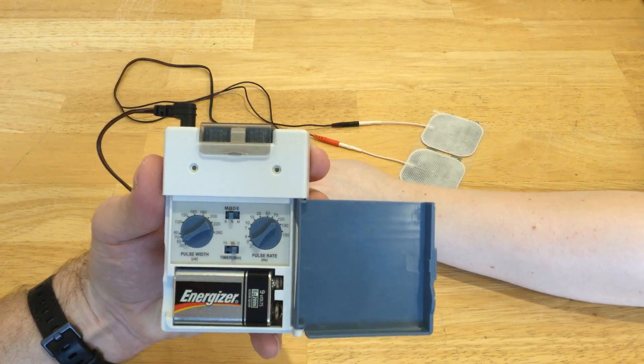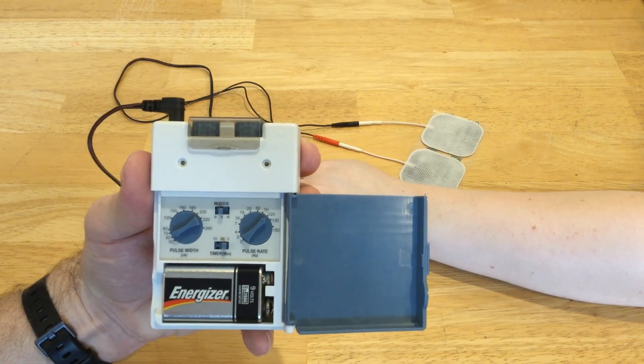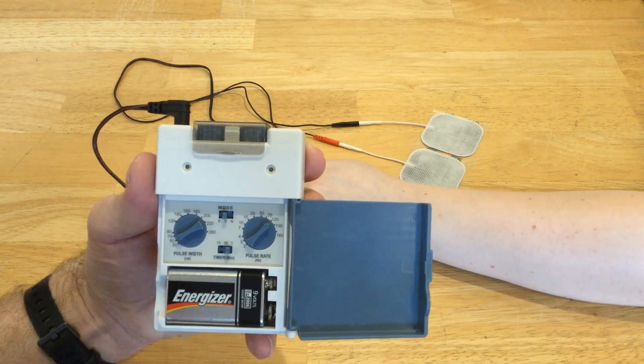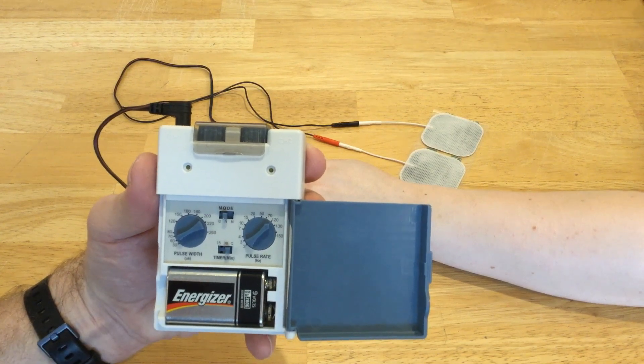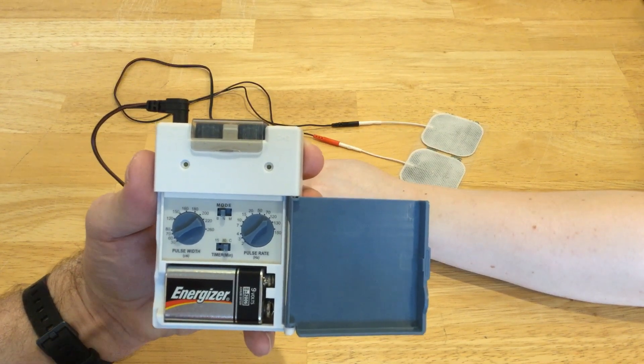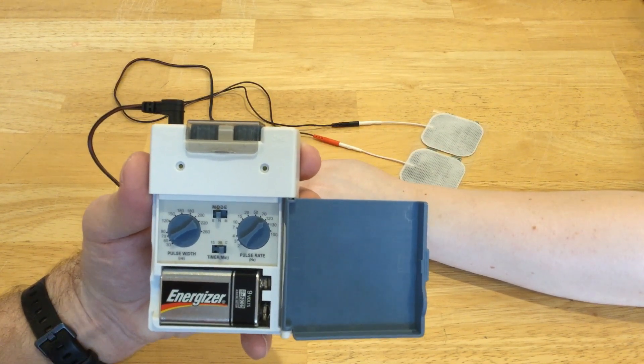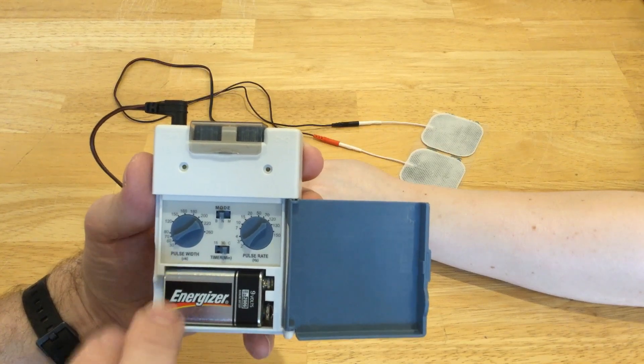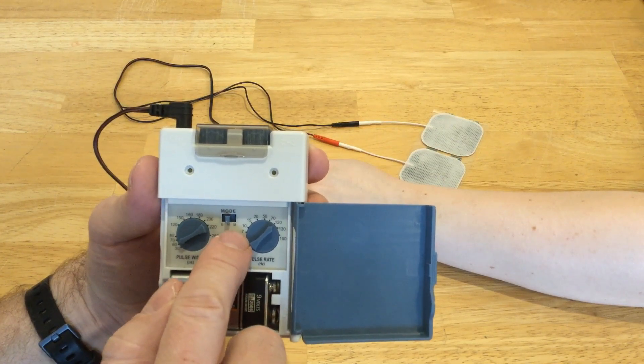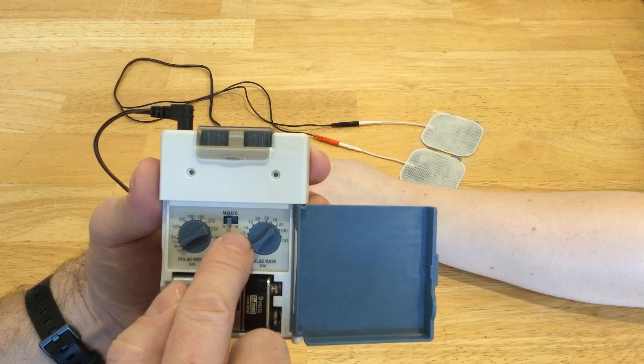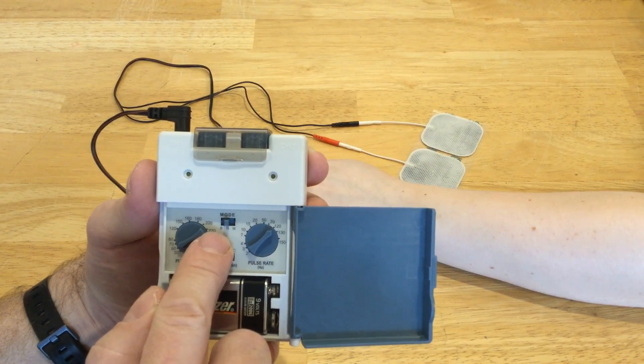For mode, I just have it set on N, which means not modulated. That's the most straightforward waveform and easiest one for clients to get used to and be able to report what they're feeling. You can also put it on M for modulated or B for burst.